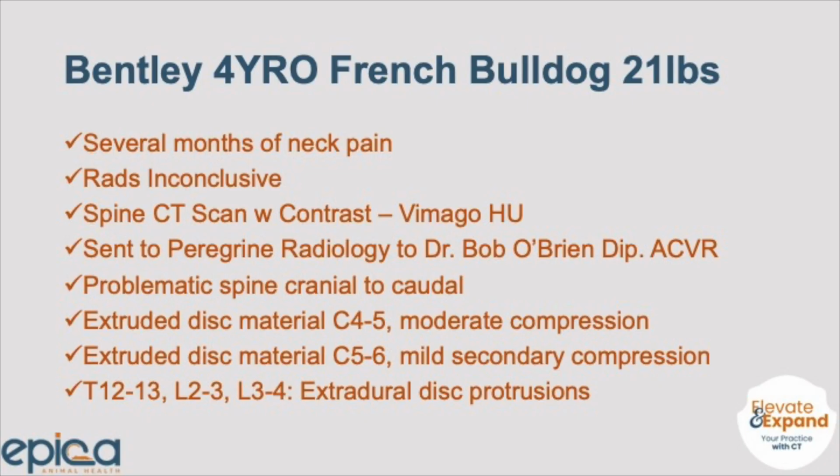Bentley is a 4-year-old French bulldog who weighs 21 pounds. He's been experiencing neck pain for several months. Radiographs were taken, but were inconclusive. A spine scan was done by a Vimago HU, which was a second generation Vimago at this specific practice. The images were sent to Dr. Bob O'Brien at Peregrine Radiology.